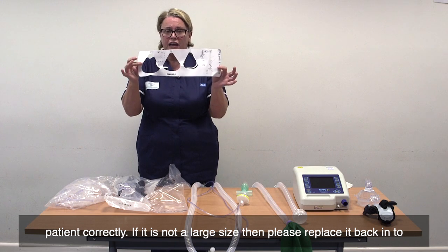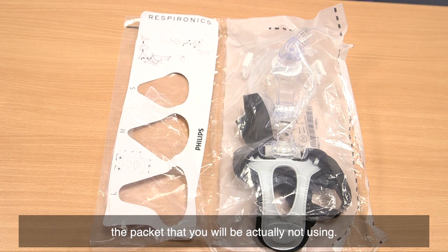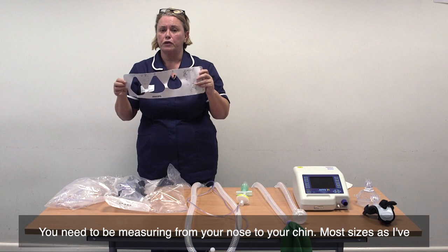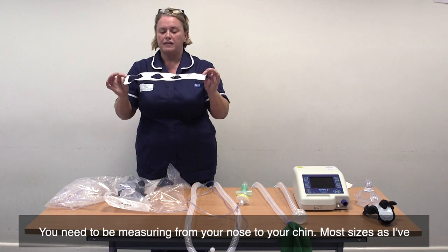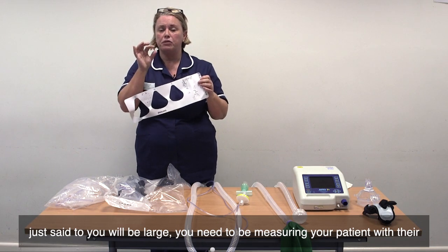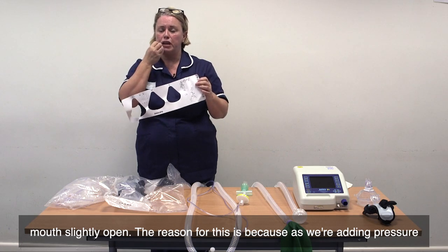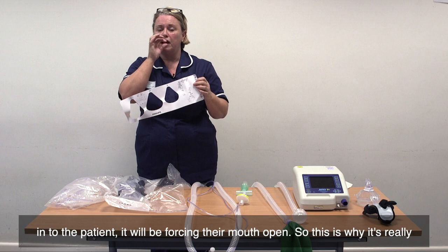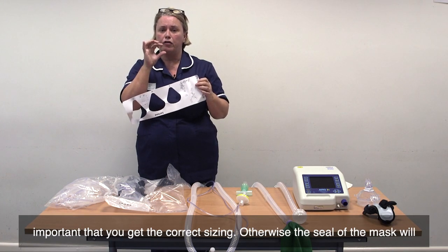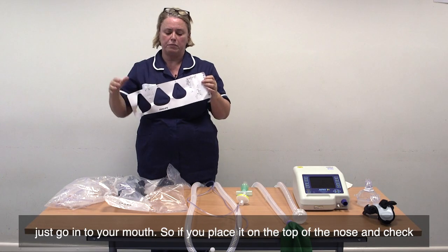If it is not a large size, then please replace it back into the packet. You need to be measuring from your nose to your chin. Most sizes will be large. You need to be measuring your patient with their mouth slightly open. The reason for this is because as we're adding pressure into the patient, it will be forcing their mouth open. So this is why it's really important that you get the correct sizing — otherwise your mask and the seal of the mask will just go into your mouth.